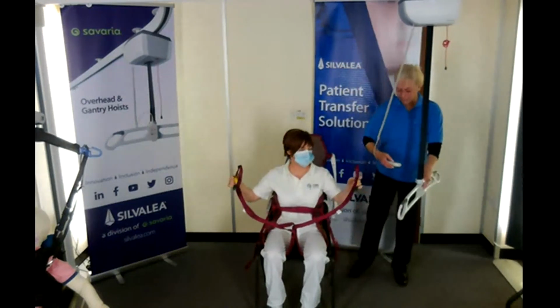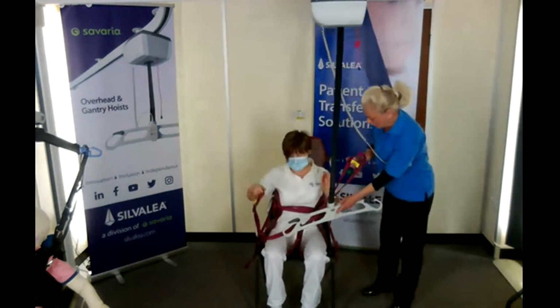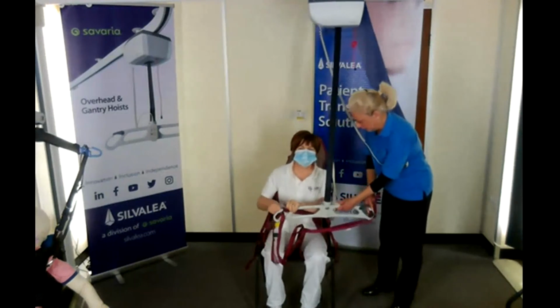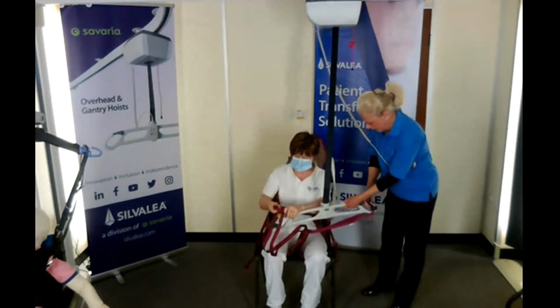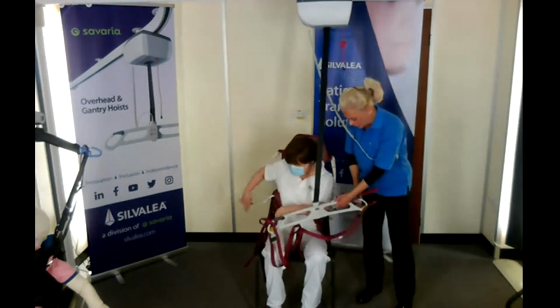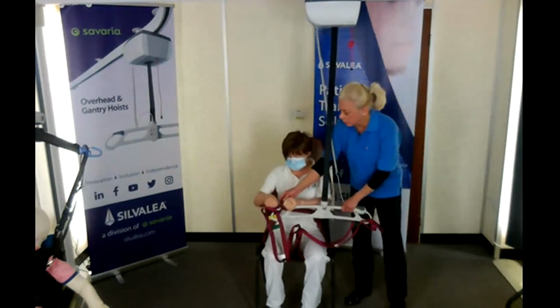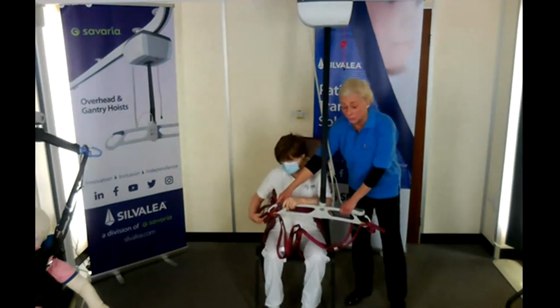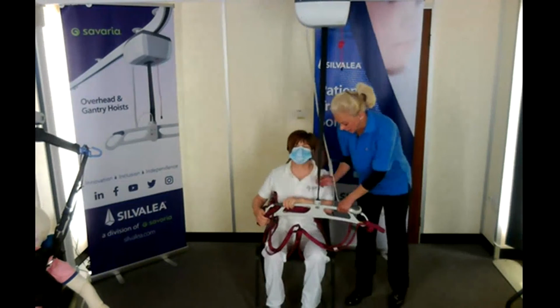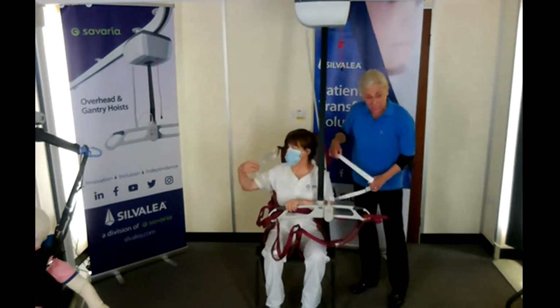We'll just hook it up slowly, and we'll go yellow. Yeah. Yellow on the leg. It's all color coded to help with positioning, which you have to then determine once you're doing your risk assessment initially to work out the most appropriate. But there's lots of options here. We know with Judith that we've got it on the yellow leg and then the red thoracic section. But the counterbalance needs to go on last.